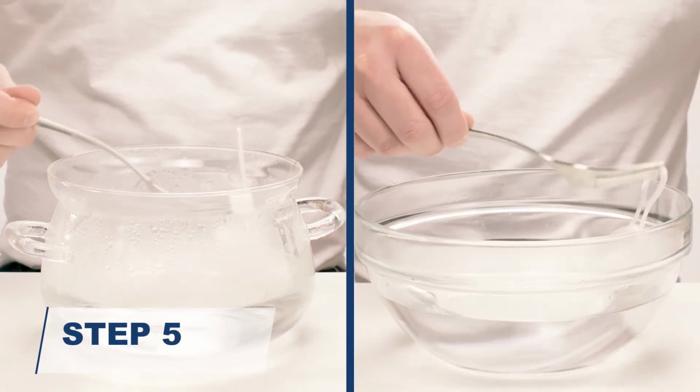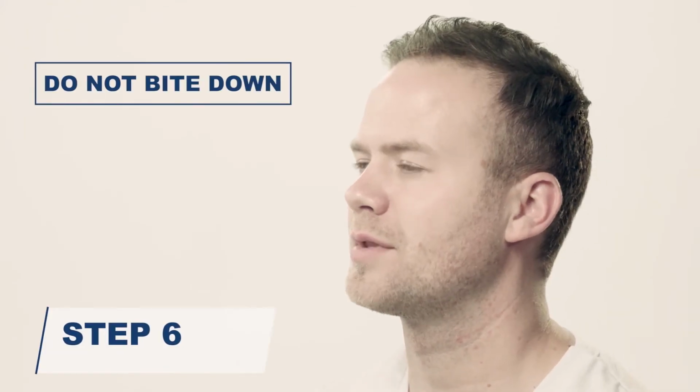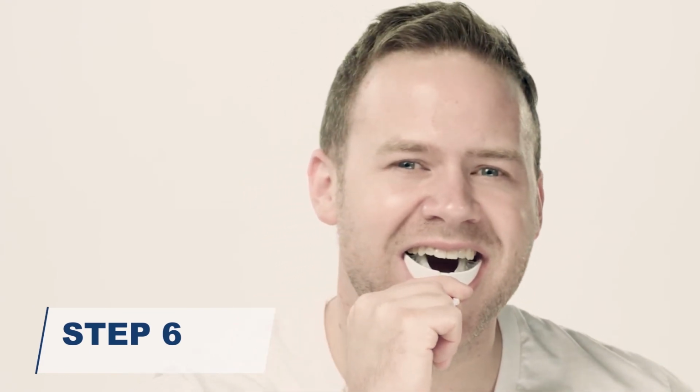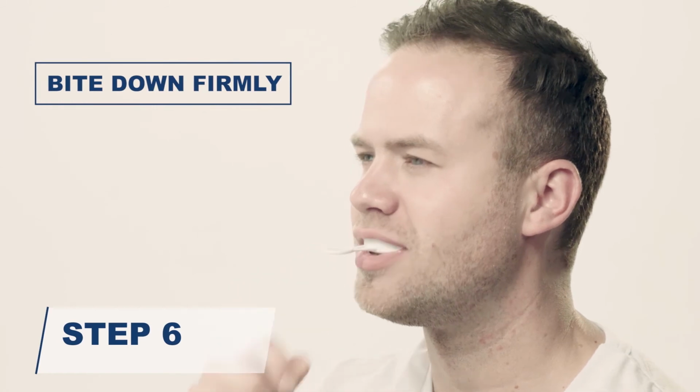Remove the tray with a metal fork. Quickly rinse under cool tap water for 1 second. Immediately pick up the guard by the handle on the forming tray and place it into your mouth. Do not bite down. While looking in a mirror, center the dental guard below your 2 front teeth and the sides below your molars. Bite down firmly into the guard.